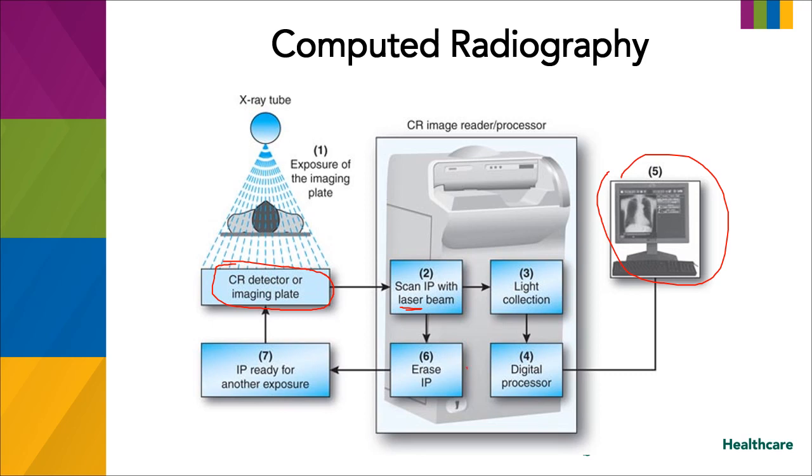We're going to erase the imaging plate, which is going to be part of the process, and then the imaging plate's ready for another exposure. So we're going to take a look at this process.